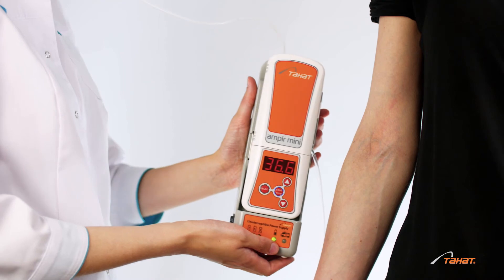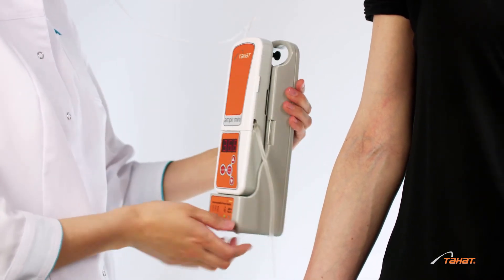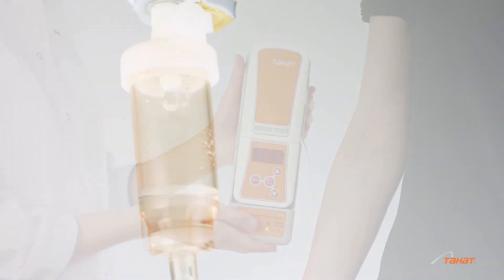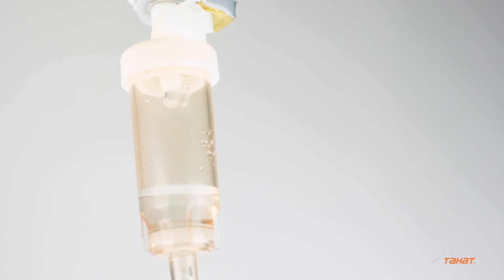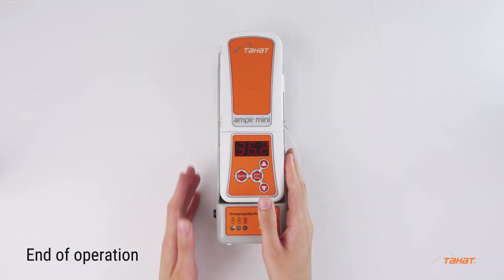Place the warming device with the battery unit in a vertical or horizontal position near the patient. Fix it with the belt to the bed or stretcher. At the end of your transfusion therapy, stop the warming process.